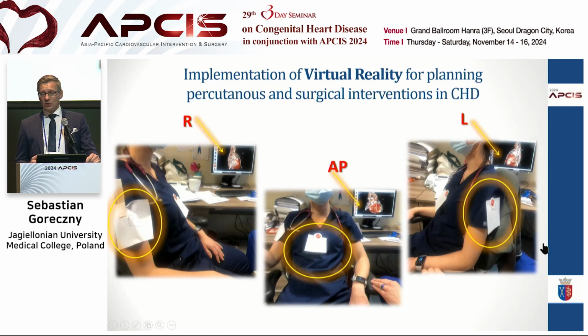When I went to Krakow to a new cath lab and they asked me to build a team there, one of the fellows wanted to work in a cath lab, and I tried to explain 3D anatomy to her. So I tried to correlate a CT image on a flat 2D screen with her orientation, and there was a group of fellows also watching it. And I thought, well, that's not the way to go. We have advanced imaging technologies.